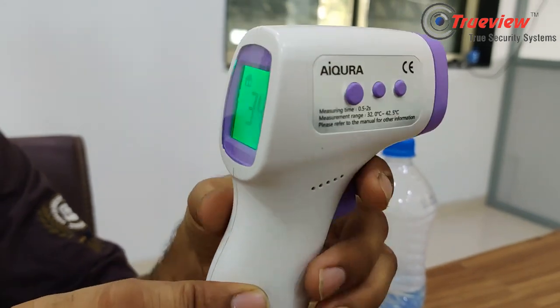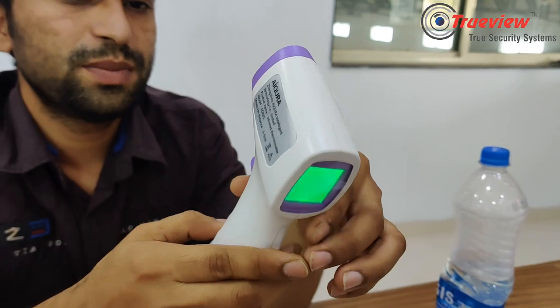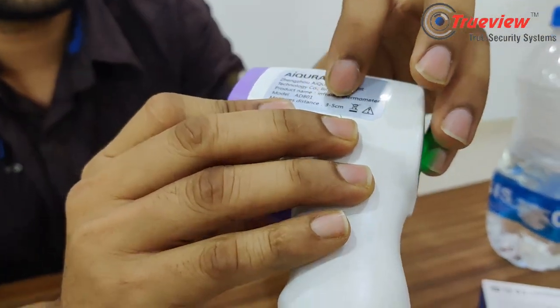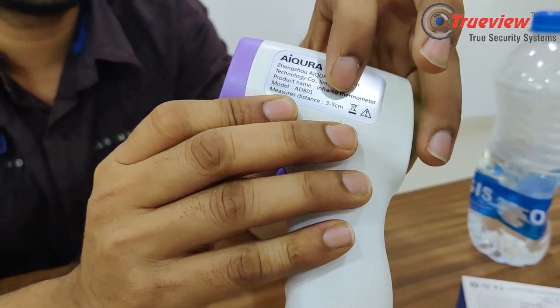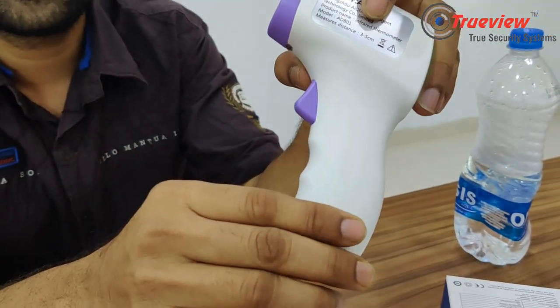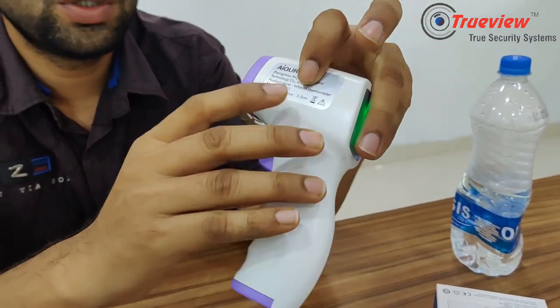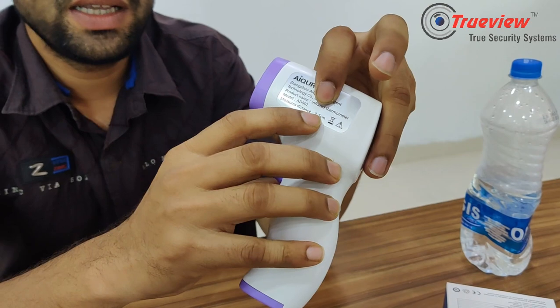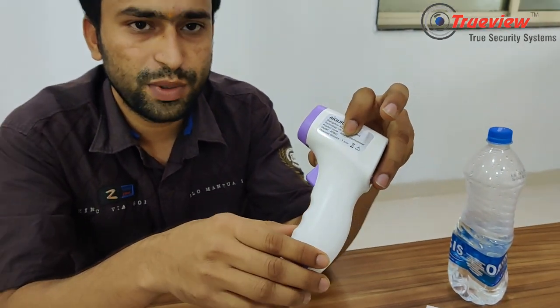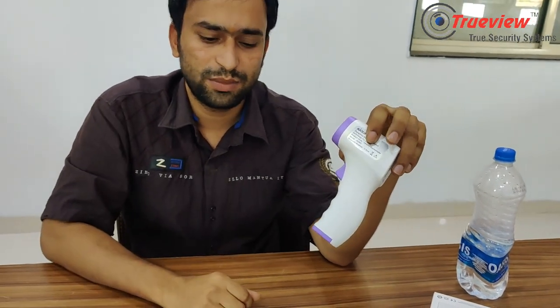Now for configuration and use, there are some parameters you need to know. The measurement distance is 3 to 5 cm for body temperature measurement. If you hold it farther than that, you can get a false reading. So please ensure the measurement distance is 3 to 5 cm.